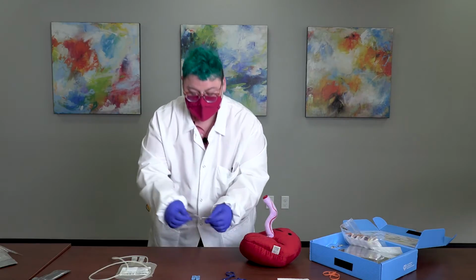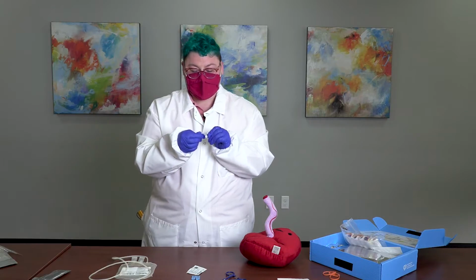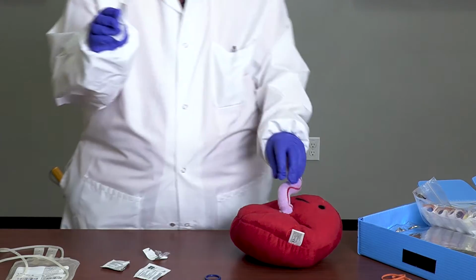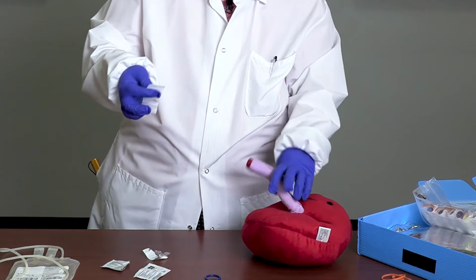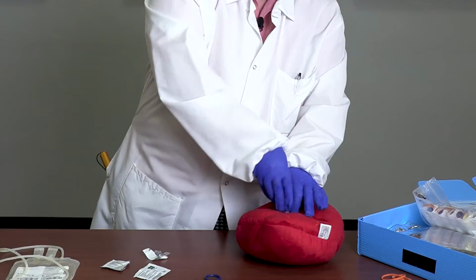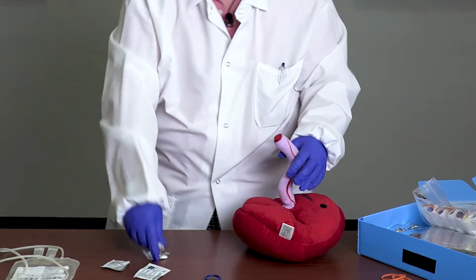The first step to collecting the cord blood is cleaning. The first thing you'll want to use is the chlorhexidine swab. And this will be used just to wipe any biological residue from the umbilical cord. We recommend using the swab to pull as much biological residue as possible.